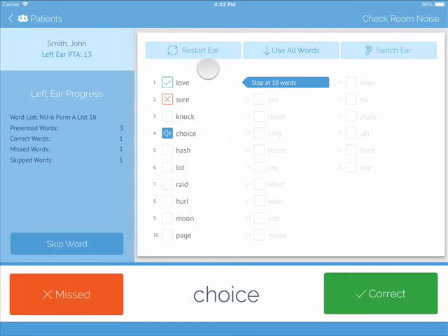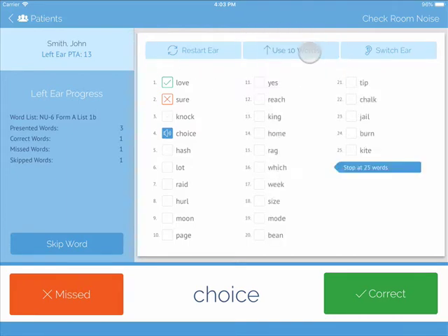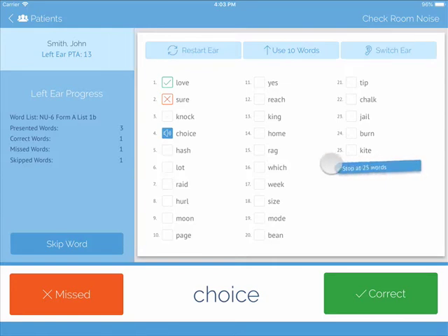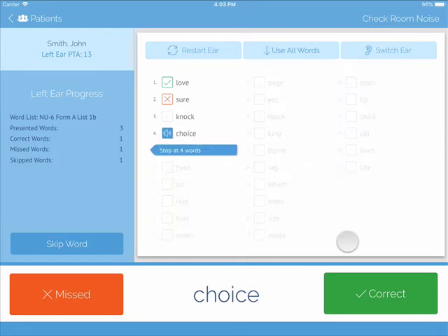Across the top, you will see Restart Ear, Use All Words to take you from 10 to 25 words, or Switch Ears. You can also customize the number of words that you wish to present. If you tap and hold your finger on the blue Stop at 25 words, it will wiggle. When it starts to wiggle, you can move it to anywhere on the list.